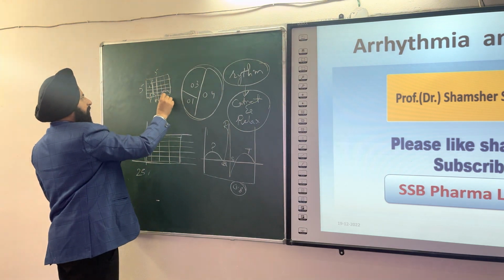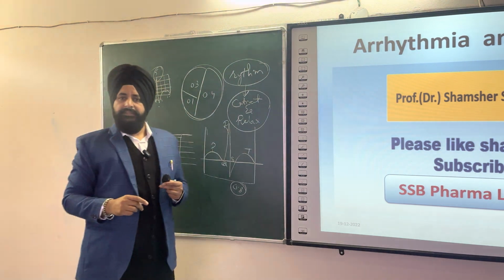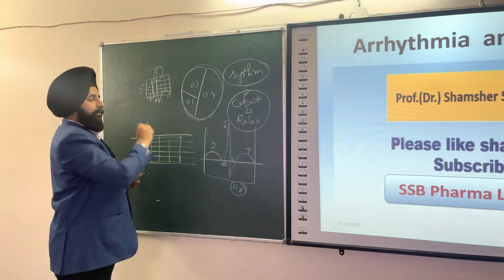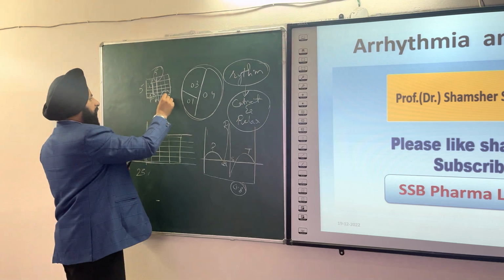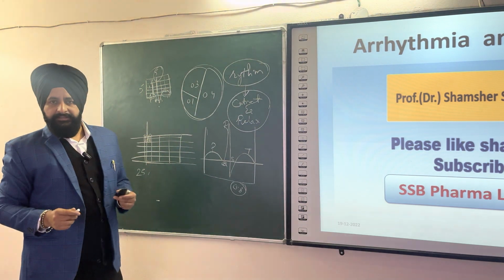This R wave is an indication of your ventricular contraction, this P wave indicates your auricular contraction, and your T wave indicates your ventricular repolarization.